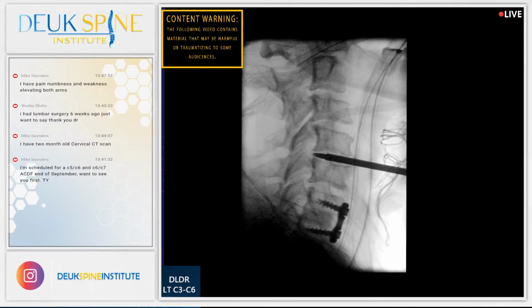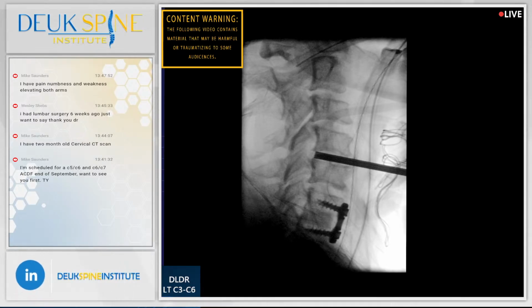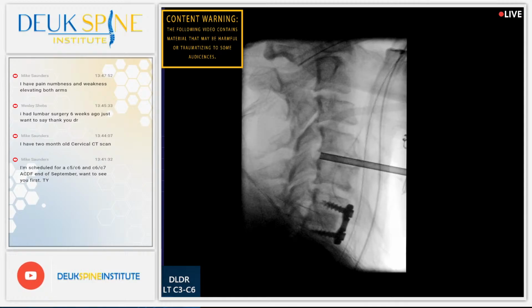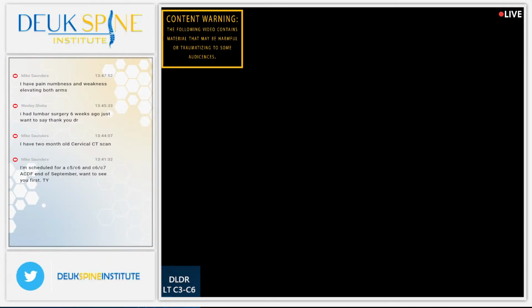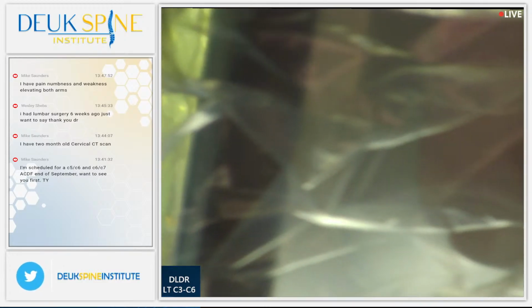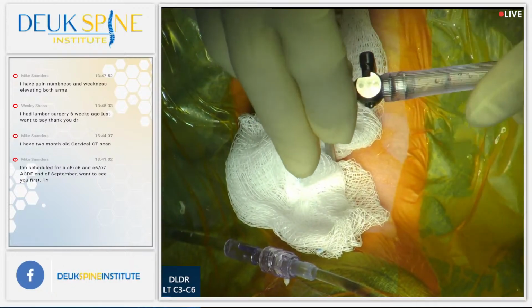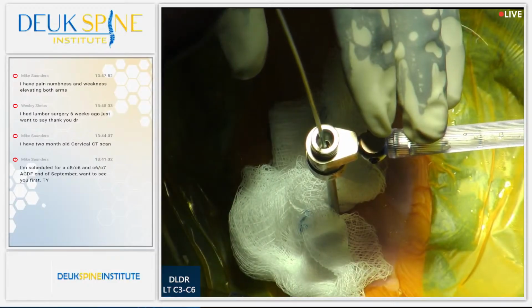You can see the herniation there. It's literally sitting inside the herniation. As long as it doesn't go past the herniation, I'm happy. All right, we're there. We're at the back of the disc. You can see it on the x-ray. Now we're going to go in again endoscopically and remove the herniation as much as we can, clean the annular tear, debride it. And then we'll move on to our last disc for this patient from upstate New York.